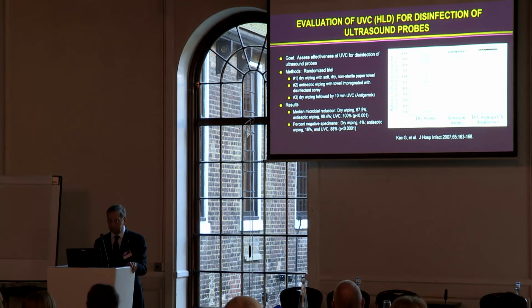A nice study by Dr. Kack assessed the effectiveness of UVC for disinfection of probes. Again, they were wiped, antiseptic sprayed, and microbial dry wiping, antiseptic wiping was 98% effective, but again, you're still missing 2%, very important, and ultraviolet light was 100% effective.